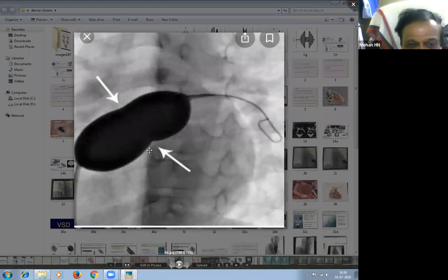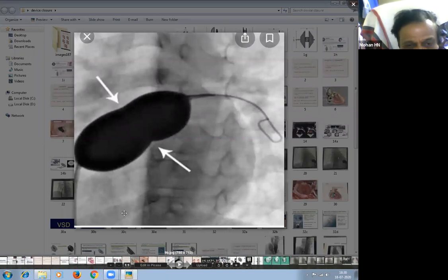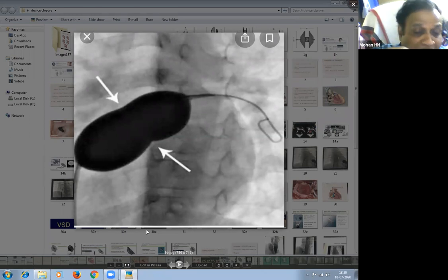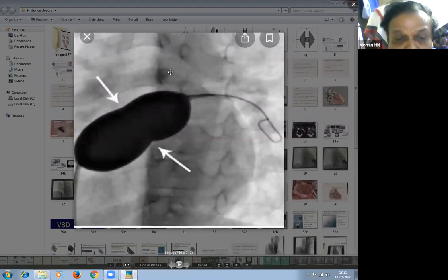ASD, that volume we will measure outside, and we have a sizing plate with holes of 10 mm, 12 mm, 14 mm, 16 mm, 18 mm, up to 38 mm. Whatever volume we inflated inside, the same volume we inflate outside and fit that balloon inside the holes. Whichever hole matches, that is the size of the ASD. That is called the occluding balloon. This is the static balloon.